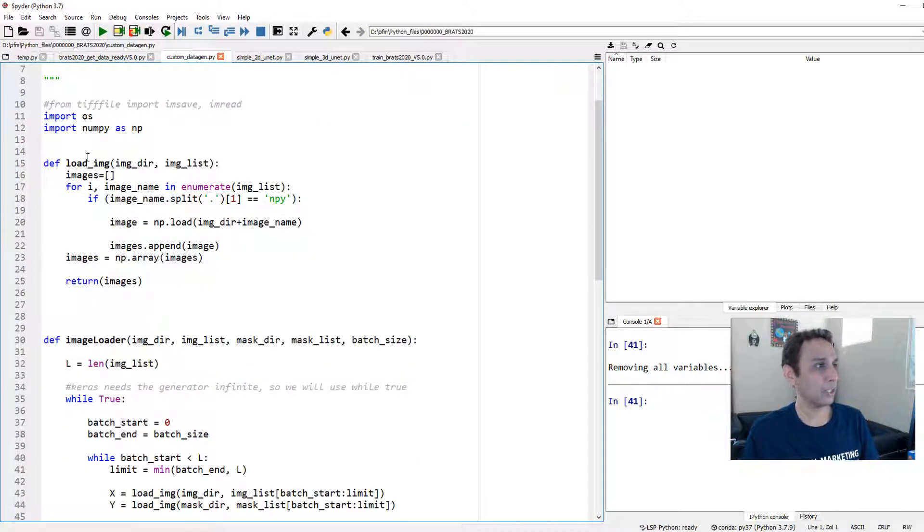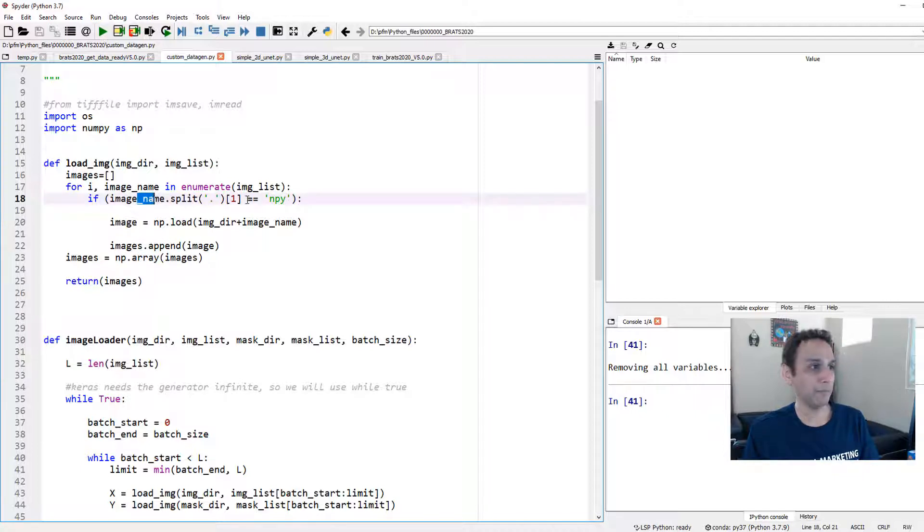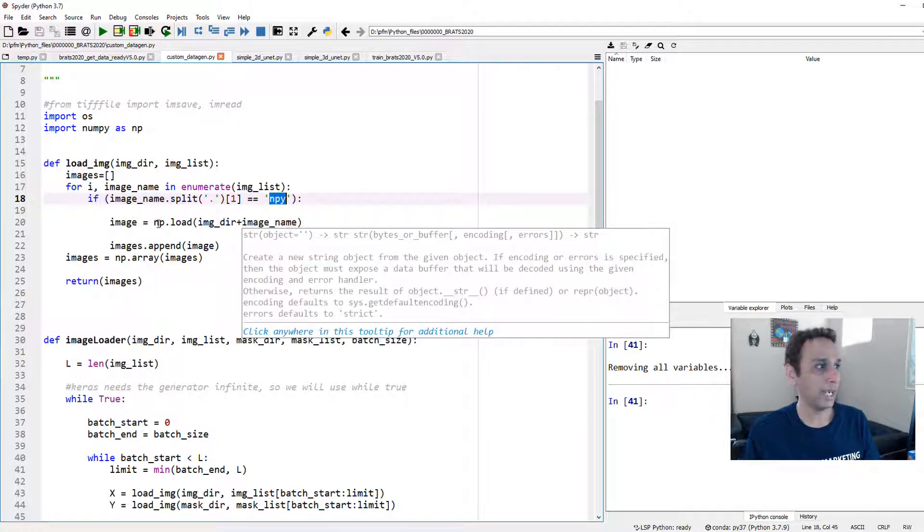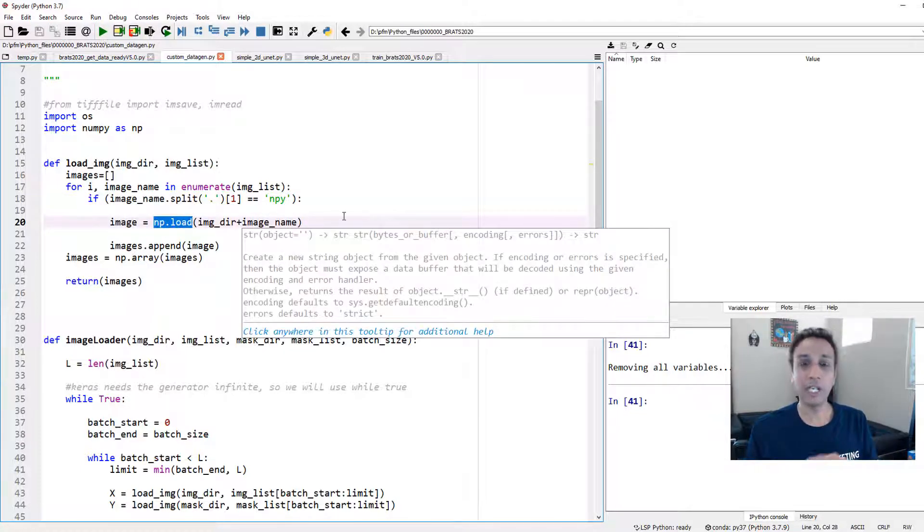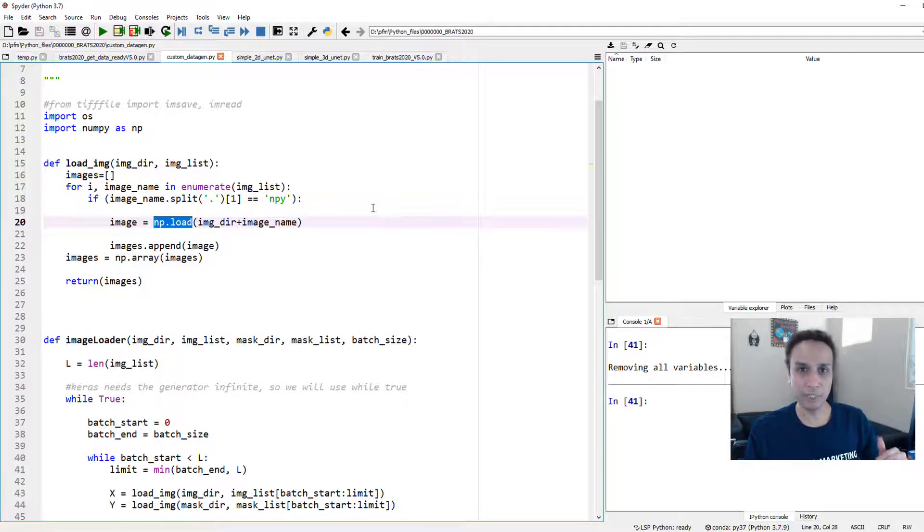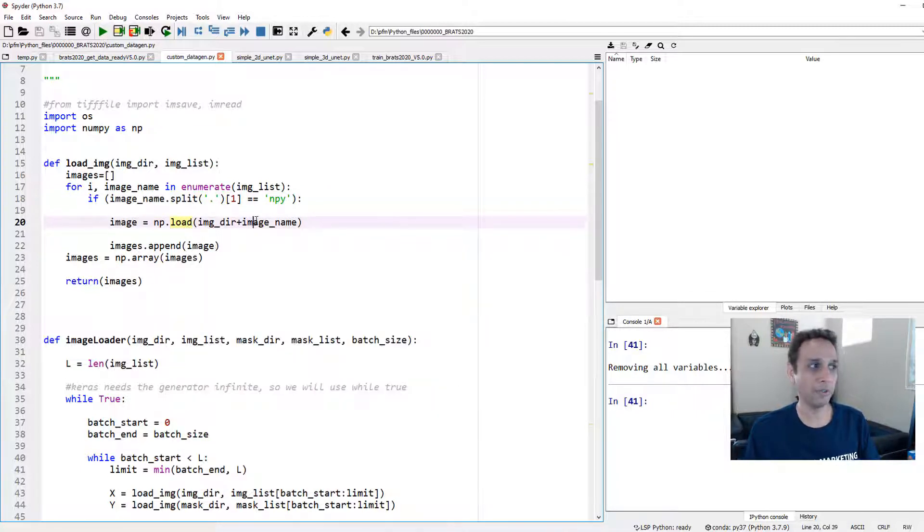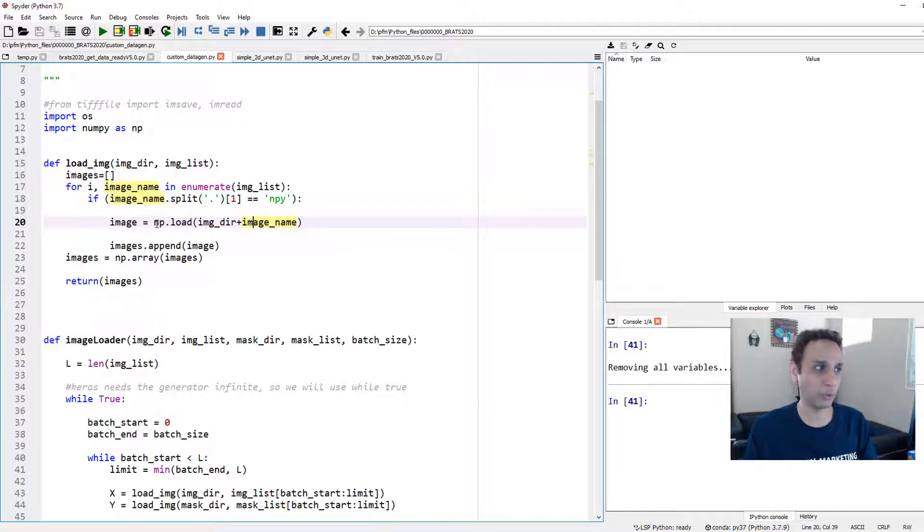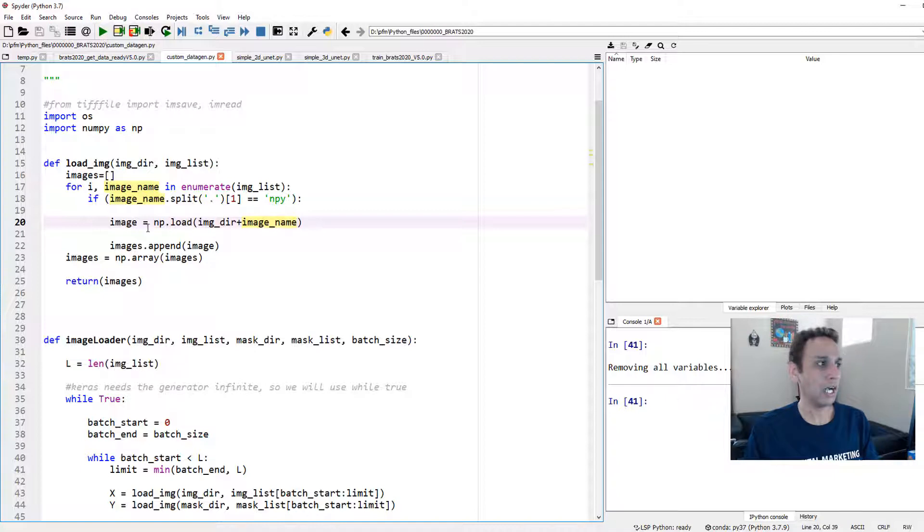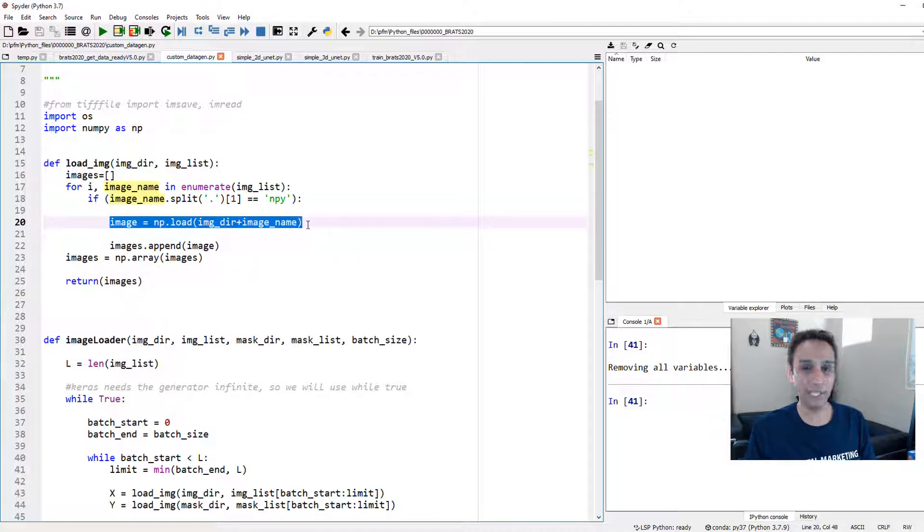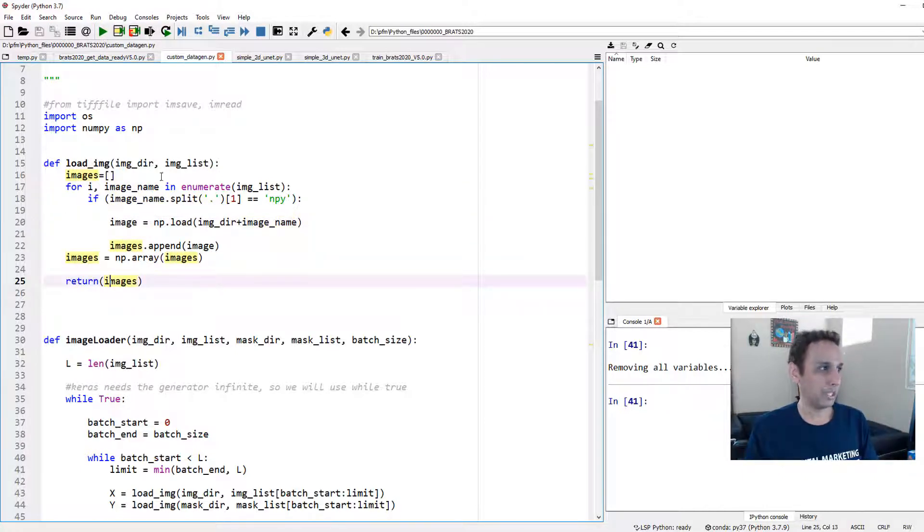So I just want to write my own custom data generator, which is very straightforward and simple. First of all, let's write a function to load the images. In our case, our images are NumPy arrays, NPY. So I'm going to say if my image name has an extension of NPY, go ahead and use np.load. If you're dealing with TIFF images or any other image formats, it can be cv2.imread or whatever function that you use to load the images.